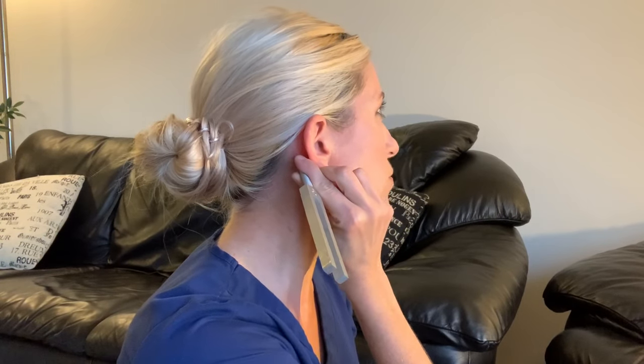I can no longer hear the tone on the mastoid, so I'm going to bring it to the outer ear. And now I can no longer hear the sound. That would be a normal Rinne test in my right ear.